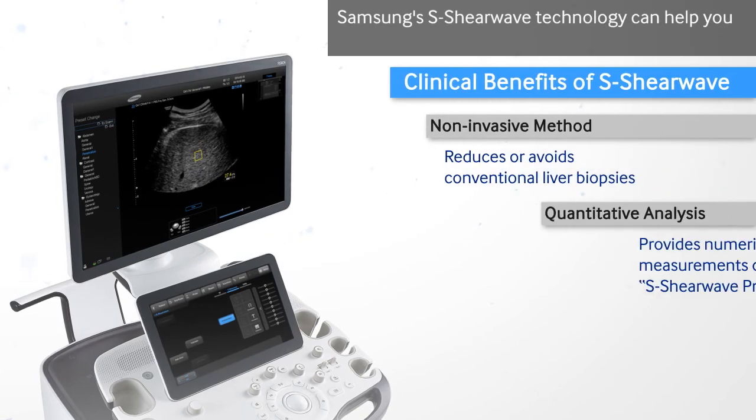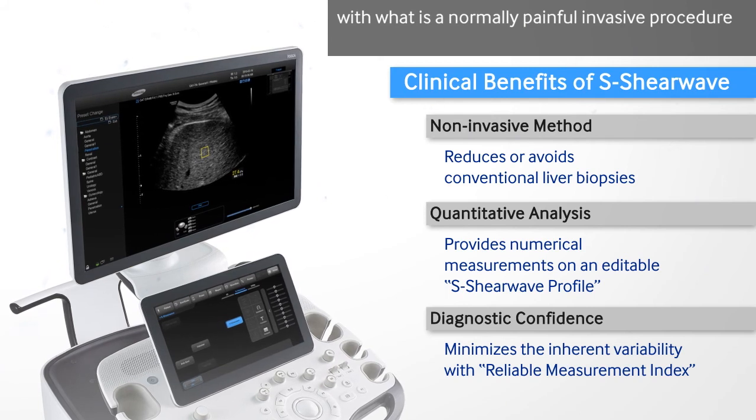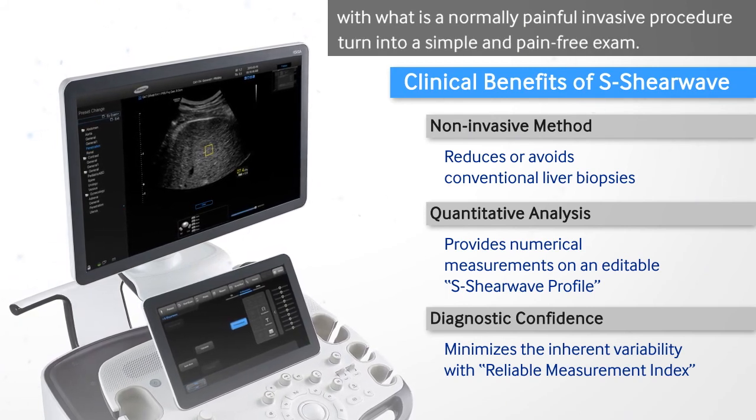Samsung's S-ShearWave technology can help you turn what is normally a painful, invasive procedure into a simple and pain-free exam.